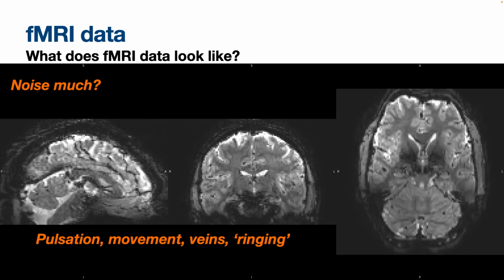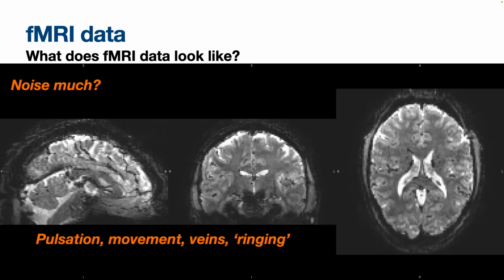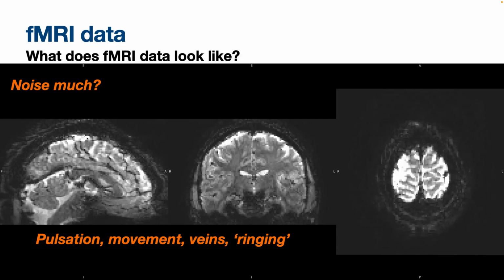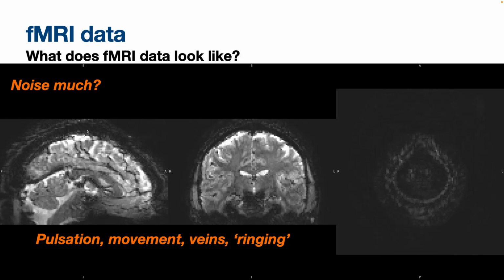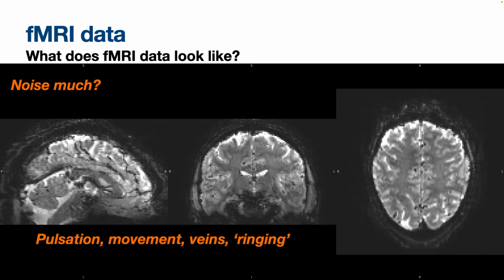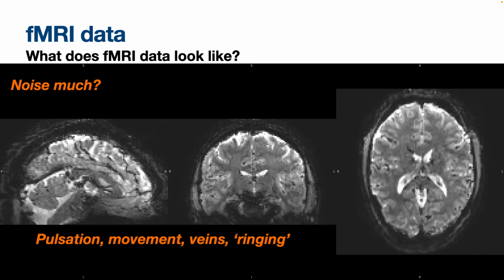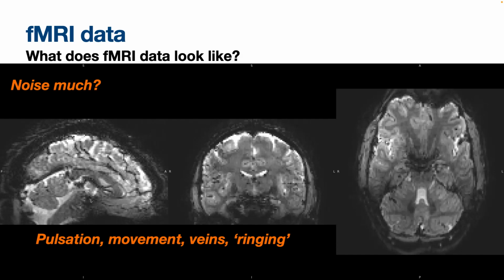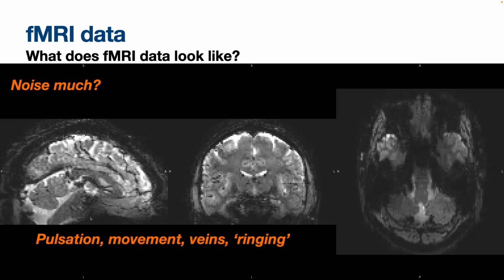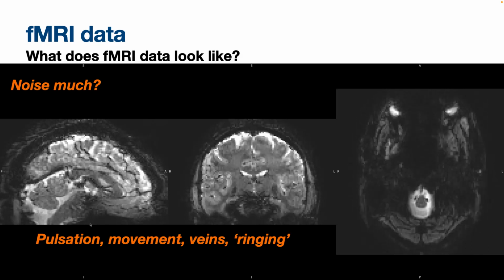Yeah? What you do see on a scan like this is me just traversing the scan, right? This is not an artifact or whatever. This is me just going through. You can see the mouse pointer here somewhere. And I'm going back. What you see is that there's a lot happening in the middle of the brain. It's the heartbeat. You see the heart pumping the blood into the brain. And that's the signals that you see.